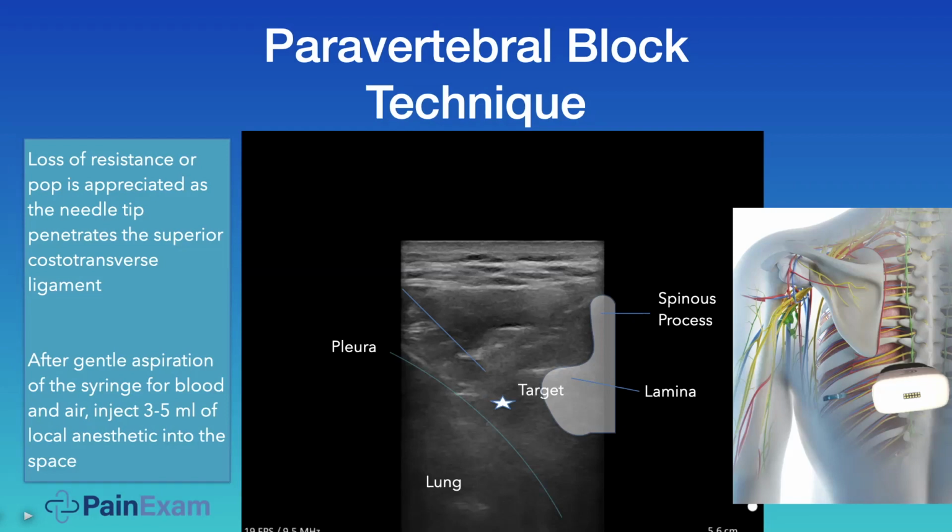If you're truly in the paravertebral space, you should not get hypotension like you would with a sympathectomy from a nerve block at the epidural space or some other sympathetic block. Speaking of which, you are getting sympathetic nerves with this. You're really getting the best of all worlds here, because you're having access to the nerve root before it splits. It's almost like a transforaminal. It's not quite as deep, but it is almost. You're getting the sympathetic fibers that go on the anterolateral aspect of the sympathetic chain of the vertebral body.